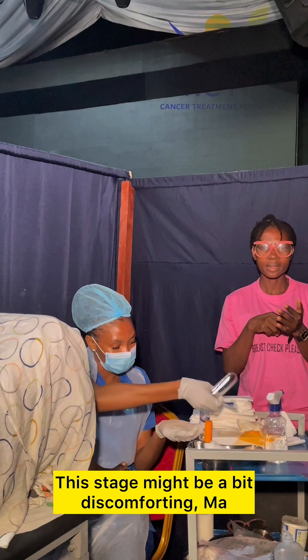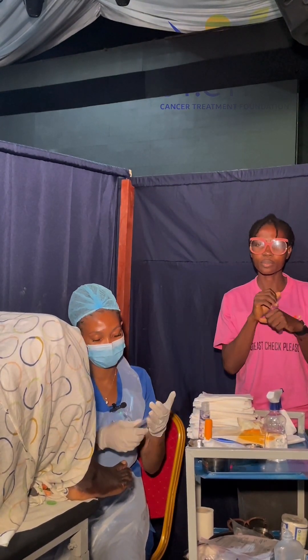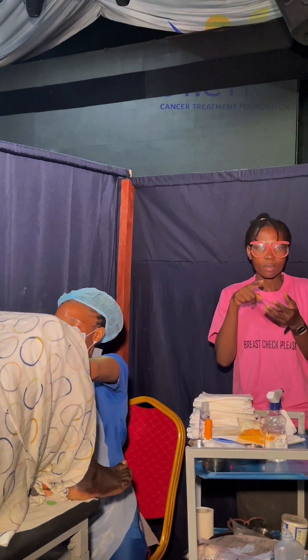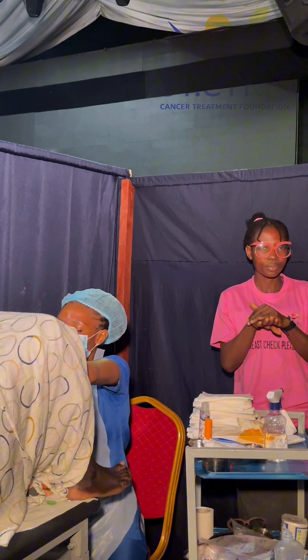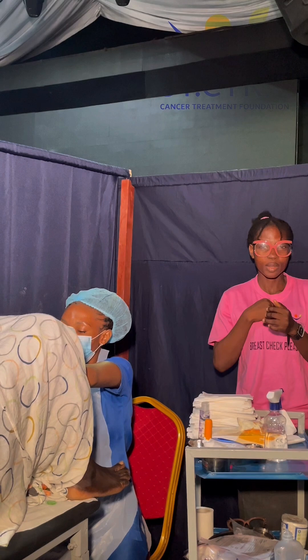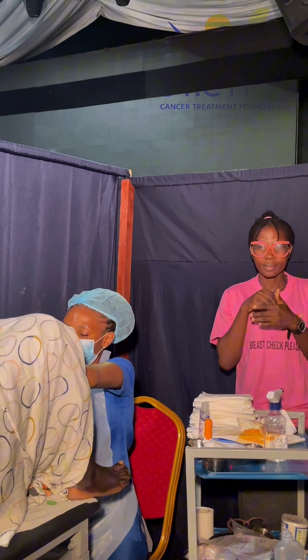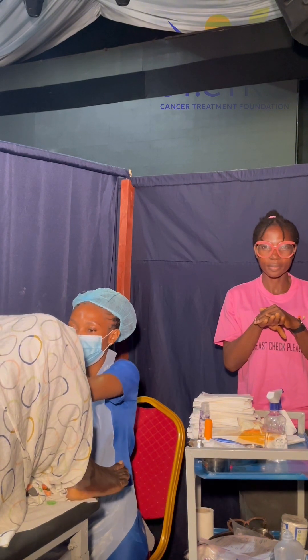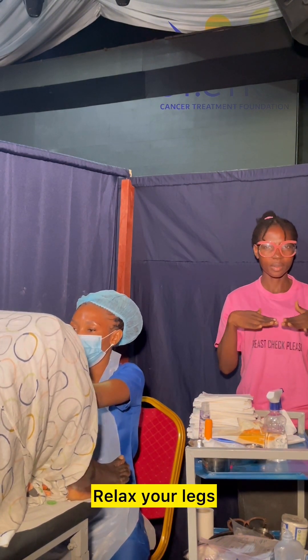This stage might be a bit discomforting now. I'm about to go in. Sorry, ma. Don't turn so much. Sorry, it's all right. Ma, just relax your legs.